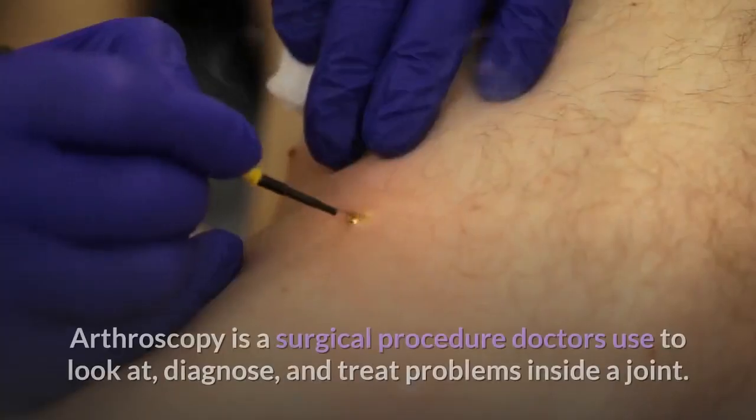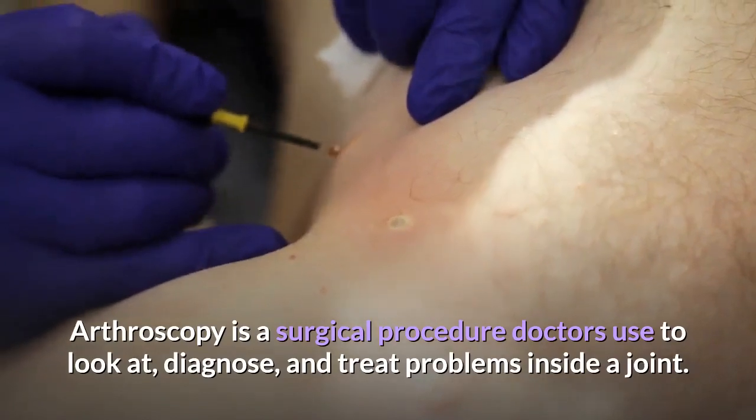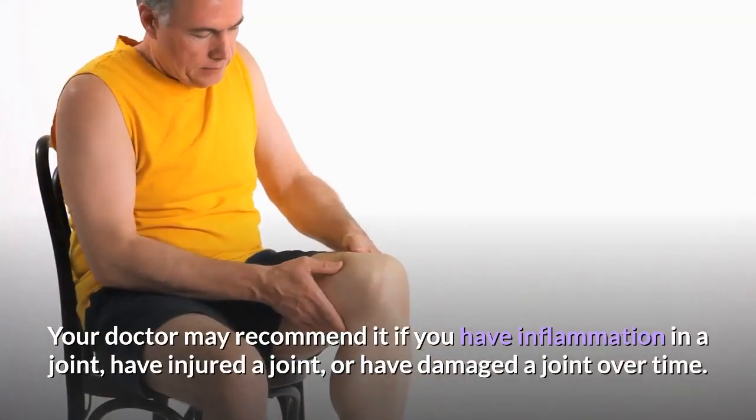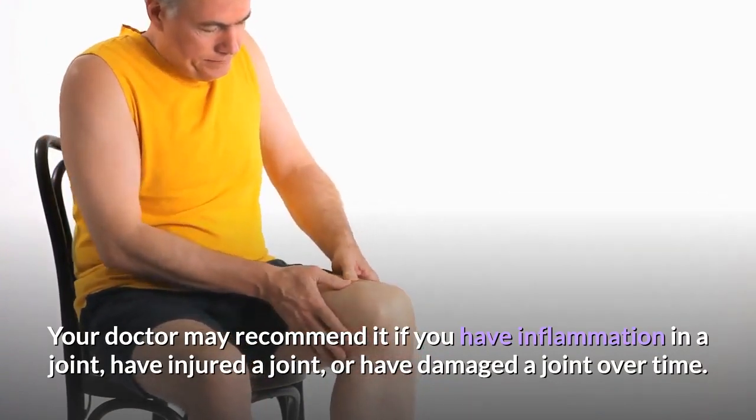What is arthroscopy? Arthroscopy is a surgical procedure doctors use to look at, diagnose, and treat problems inside a joint. Your doctor may recommend it if you have inflammation in a joint, have injured a joint, or have damaged a joint over time.